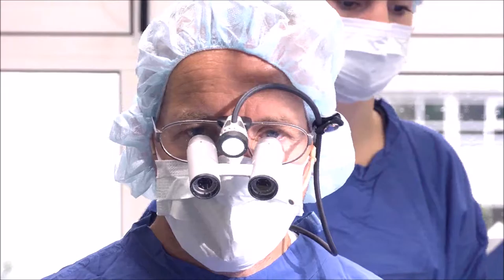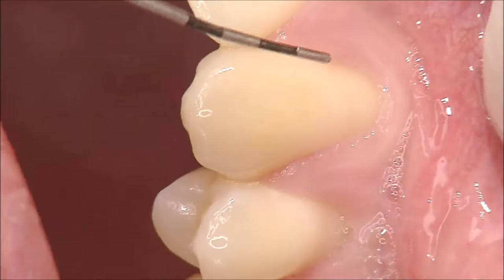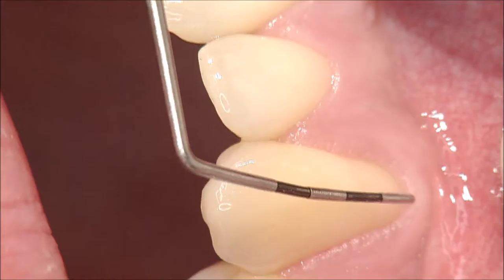For this patient, we are treating the left maxilla with a recession coverage. Here is the anatomical situation. We have a profound recession in this area. If we take the CEJ (cemento-enamel junction) as a reference, we have a recession of about 4 to 4.5 mm.